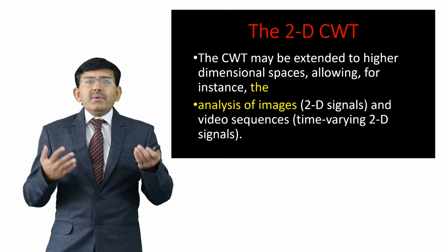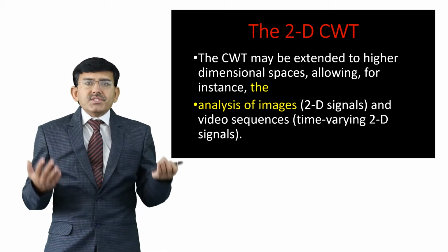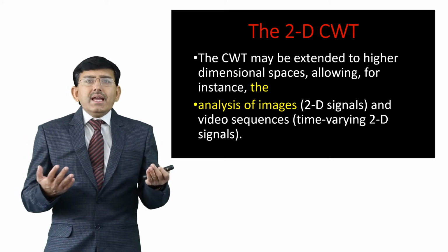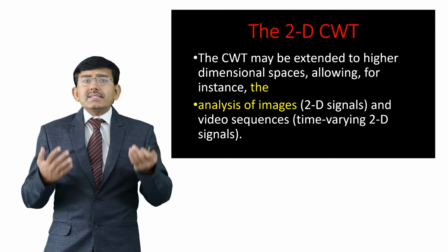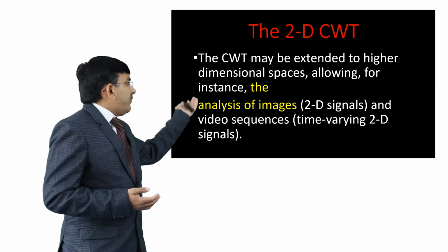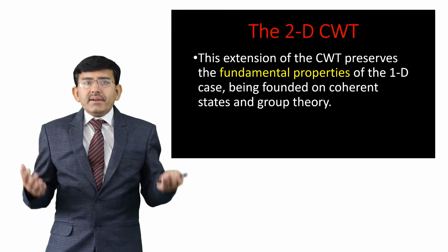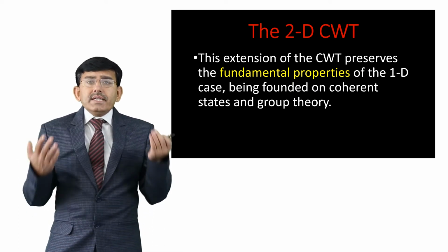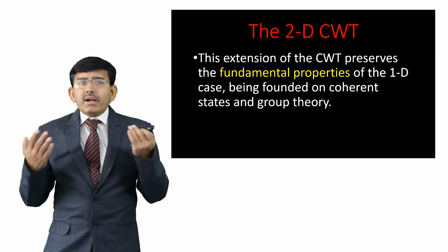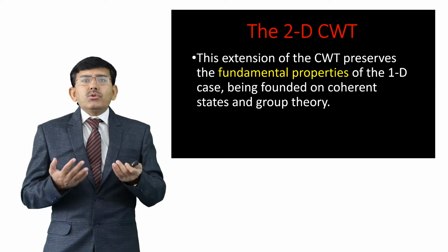The CWT may be extended to higher dimensional spaces, allowing for instance the analysis of images, that is two-dimensional signals, and video sequences, that is time varying 2D signals which may have a set of frames used to give certain actions or activities. This extension of CWT preserves the fundamental properties of the one-dimensional case, being founded on coherent states and group theory.